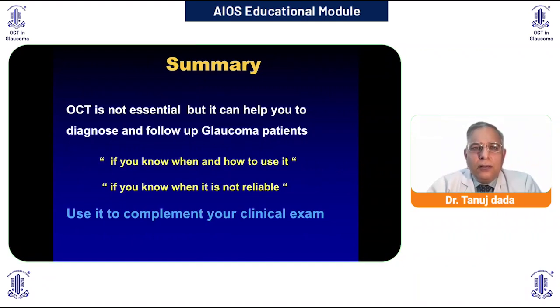So, although the OCT is not essential for diagnosis of glaucoma, it can definitely help you in the treatment and follow-up of glaucoma patients if you know when and how to use it, and if you know when it is not reliable. So use the OCT to complement your clinical examination.